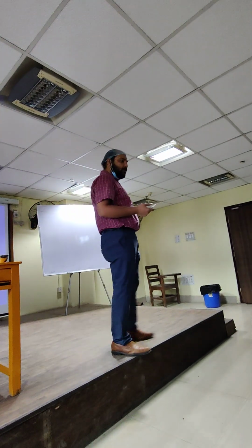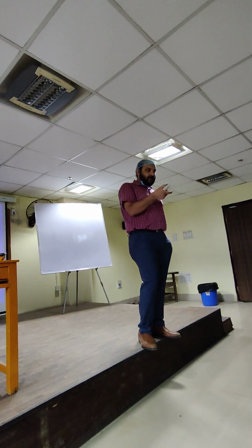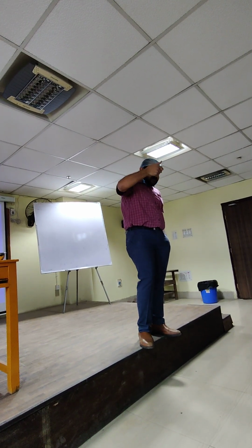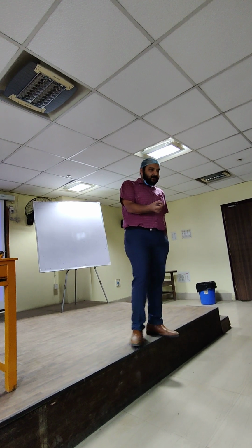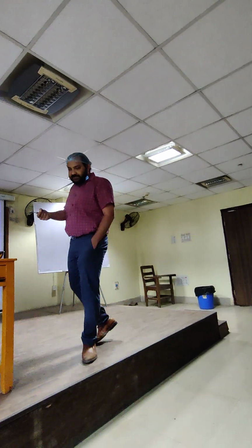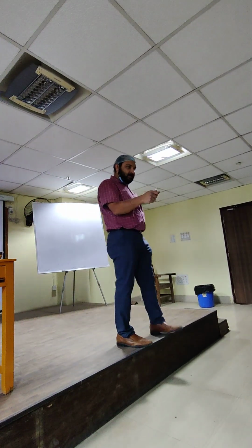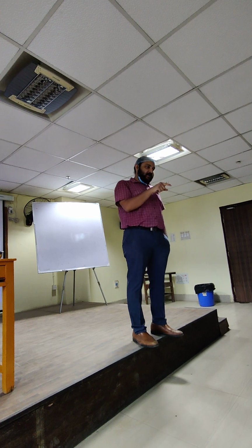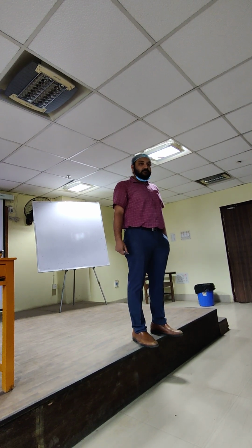Why do we hold beyond the CEJ? The weak point is present in the CEJ. You have to hold it beyond that. And also we are wedging the forces inside, which causes the wedge principle. Also it shifts the center of resistance down. If held above, the CEJ is a weak point and there can be a fracture.